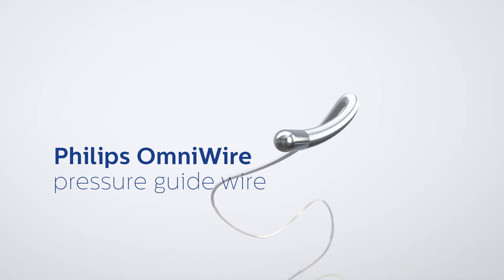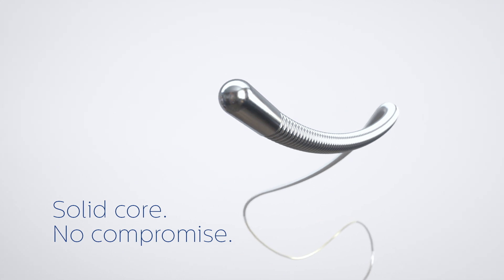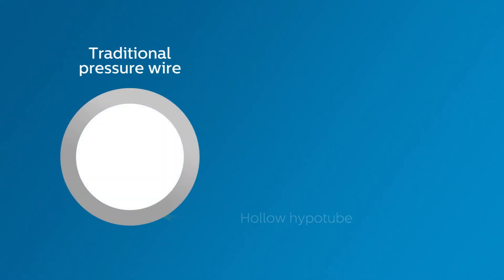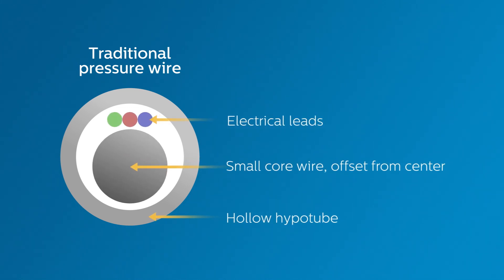Introducing Philips OmniWire Pressure Guidewire, the world's first solid core pressure wire. Until now, all pressure wires used a hollow hypotube to house electrical leads or optical fibers that carry the pressure signals.